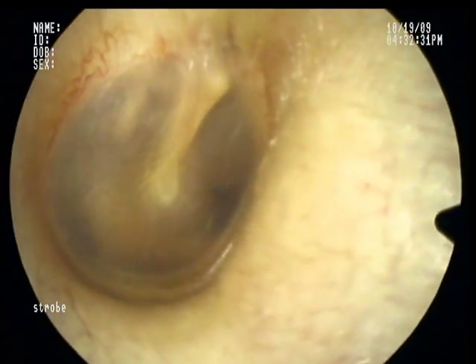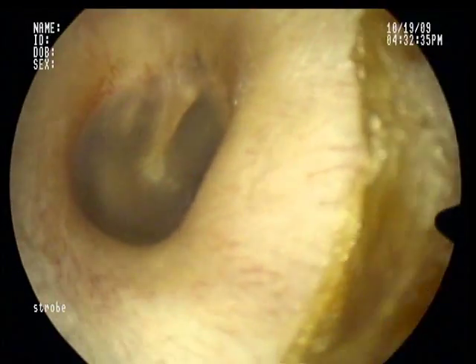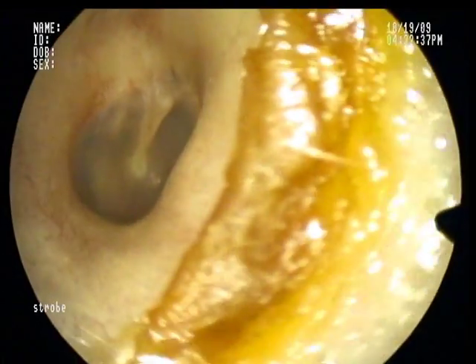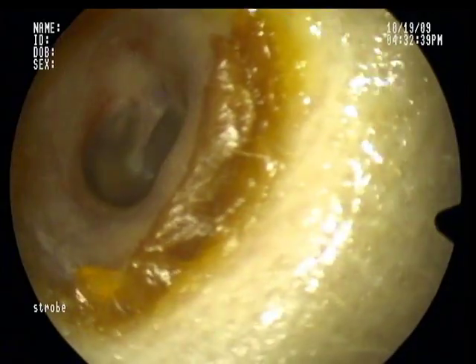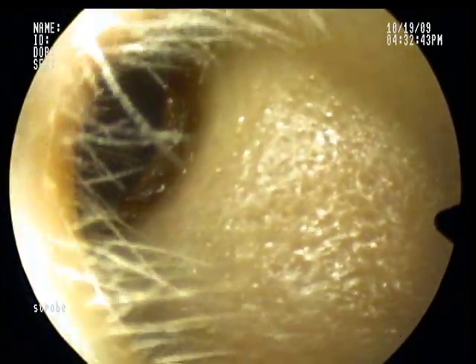And again, that's kind of the view that we see when we perform otoscopy. Here you can see a little bit of old wax in my ear canal, but otherwise a relatively normal appearing ear canal, with hair in the outer portion of the ear canal, and the remainder of my ear in general.